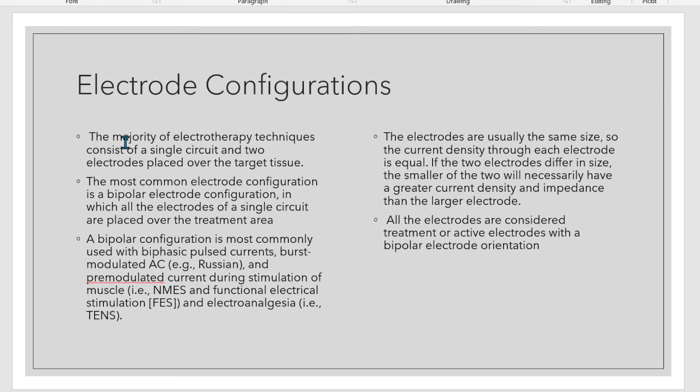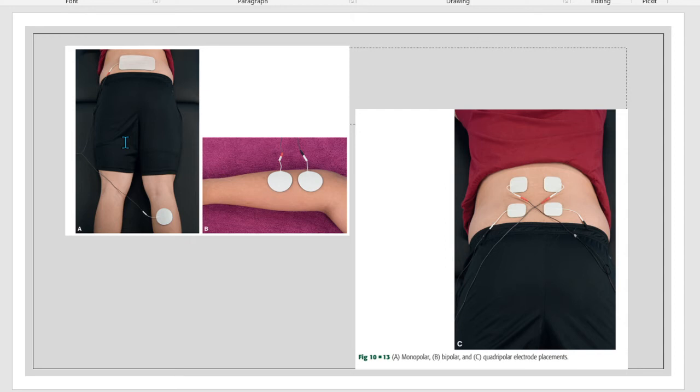Since you are using AC, expect that both electrodes are active, so there is no difference between them. There is no positive or negative because it is biphasic. It's either one of them is active and the other is dispersive, because it is alternating. After the wave changes, the other one becomes active and the first becomes dispersive, alternating in turns. So you cannot determine which is positive and which is negative, unless you are using TENS.